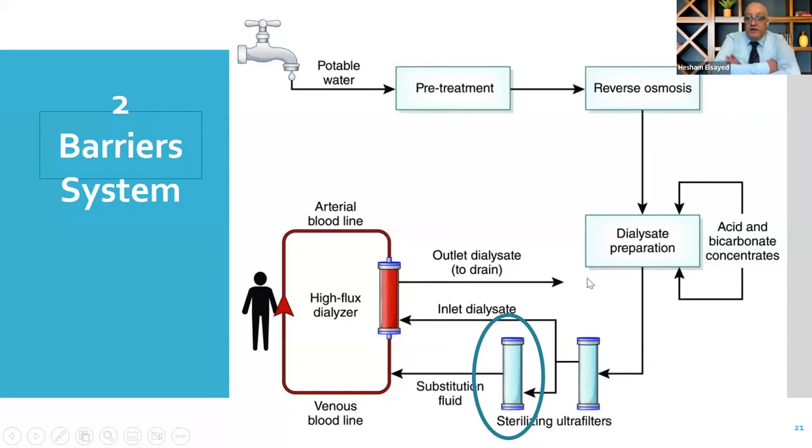The longevity of the endotoxin retention filter is around 100 sessions of hemodiafiltration or 3 months. However, frequent disinfection with chlorine damages the filter, so it is not recommended to use chlorine for more than 7 to 10 disinfection cycles overall. Otherwise, the endotoxin filter would leak. The hemodialysis machine does not check the endotoxin retention capacity. It only checks the integrity of the fibers.